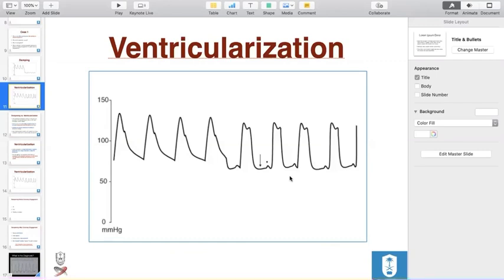Now you're gonna ask me a question. How do you know that? Maybe the catheter is within the LV, it jumped from the aorta, and that happens a lot, right? So the key here to know that is when you look at the diastolic pressure, usually the LVEDP, when you go to the left ventricle truly with a catheter, it's gonna be within the premises of 10 millimeters. Compared here, it is not, as you see, 50. So this is a hint that you're really within the artery, but actually the catheter is not in a good position, and that's why you have a ventricularized pressure.